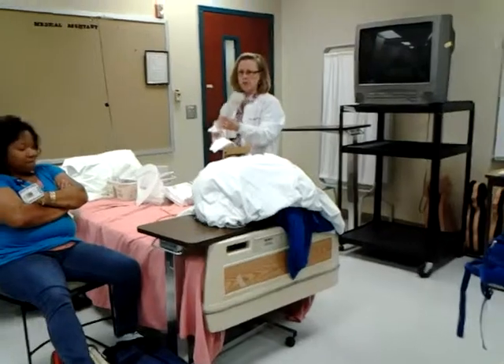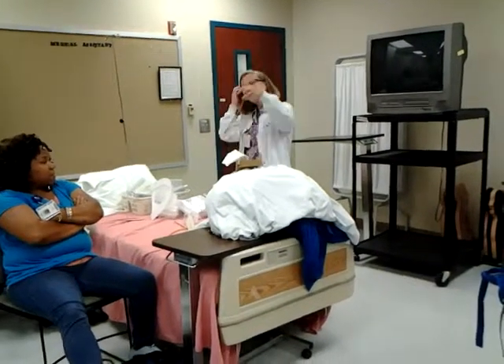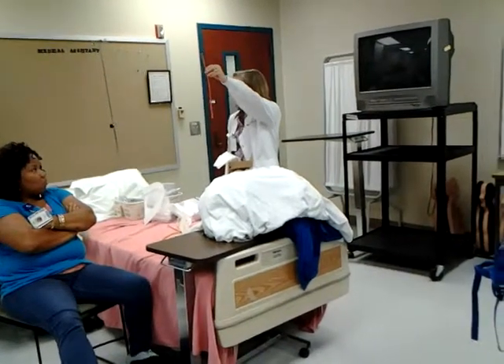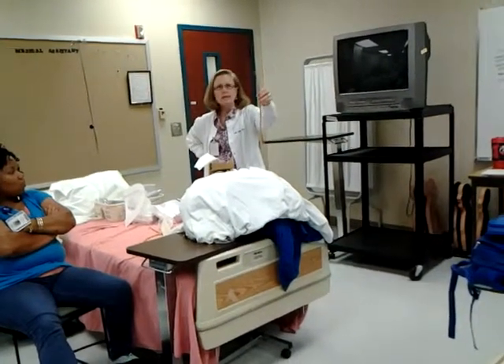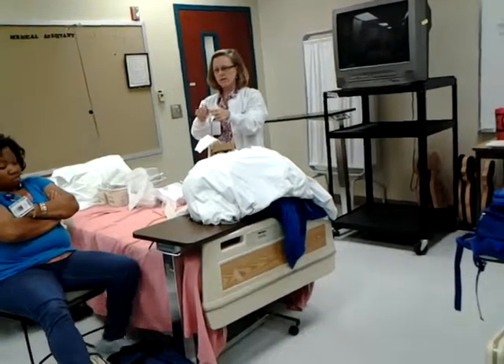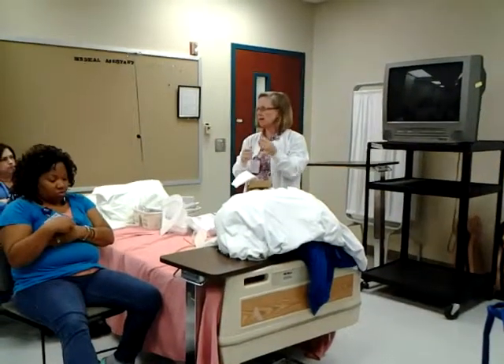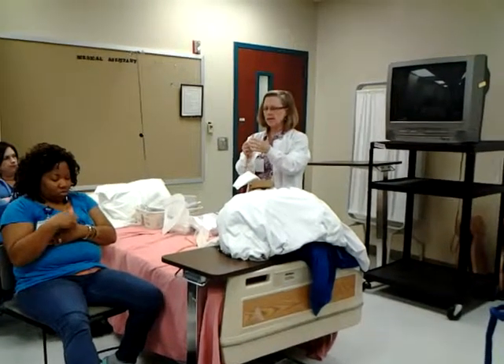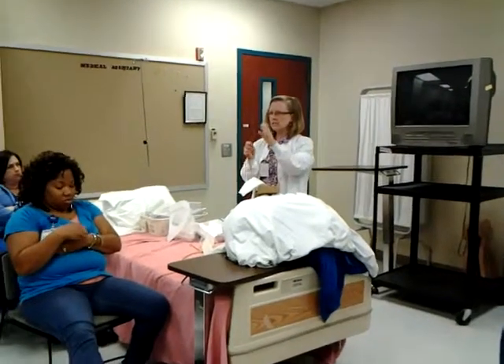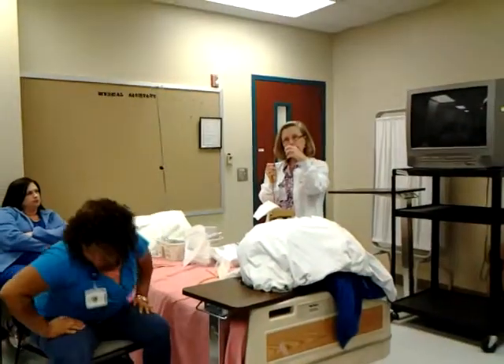This catheter is a single lumen with a bent tip — more rigid than a standard catheter. This is what we call a coudé catheter — it's rigid and bent, and it's designed for a patient who has an enlarged prostate gland.